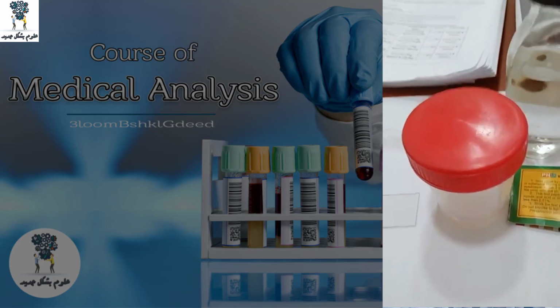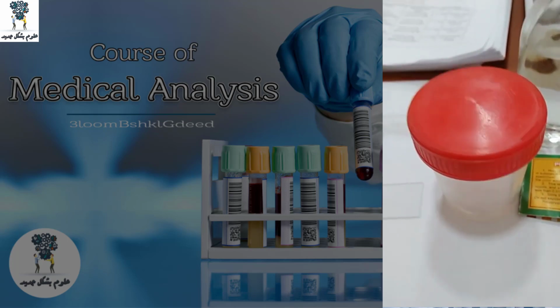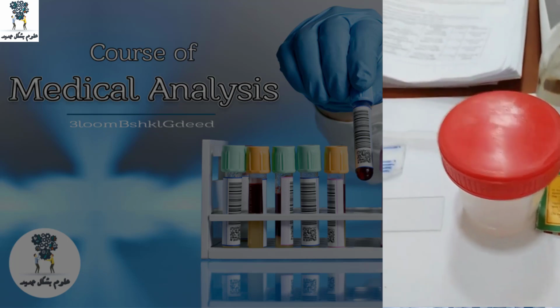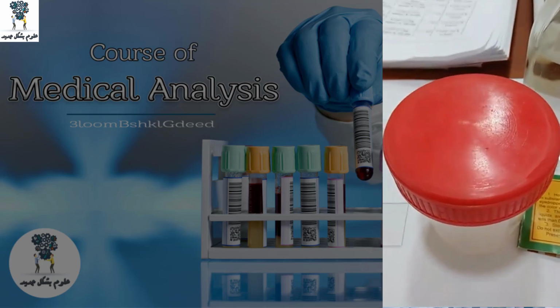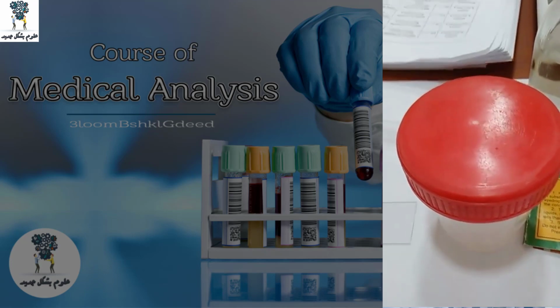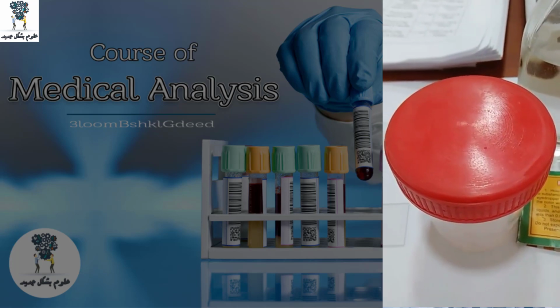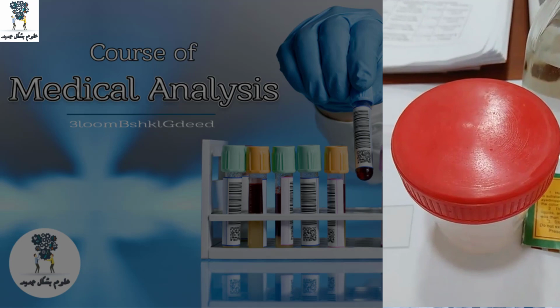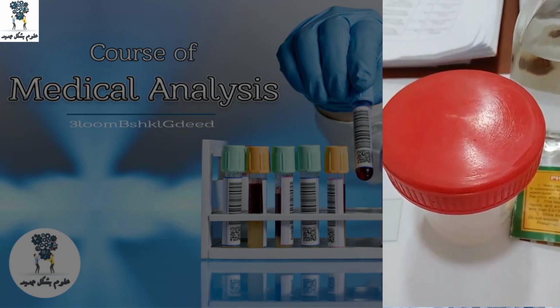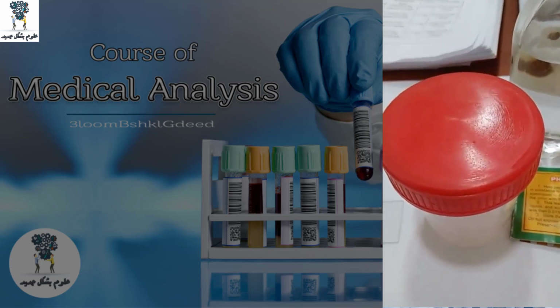So we should write that in the report, that the color is reddish or yellow, or it is normal grayish-white. And then we should measure the viscosity. There are two cases for viscosity: normal viscous or hyperviscous. Normal viscous, we can measure it. If it is hyperviscous, the meaning is that there is a problem in the sample and I can't measure or count it.